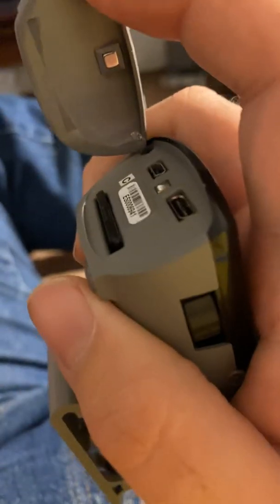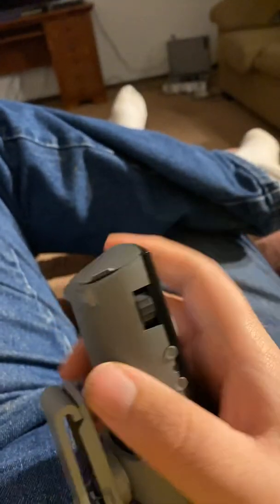Over here is a belt clip. Up here in this little door is the charging port, and this is for HDMI. Here is an SD card slot for all the pictures you can take — yes, this unit does take pictures and you can save them with this button here.